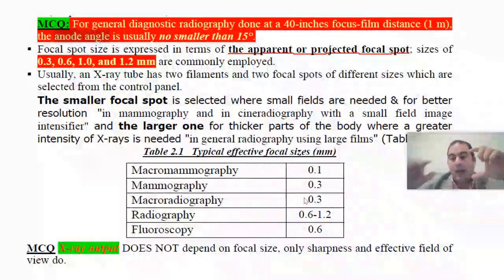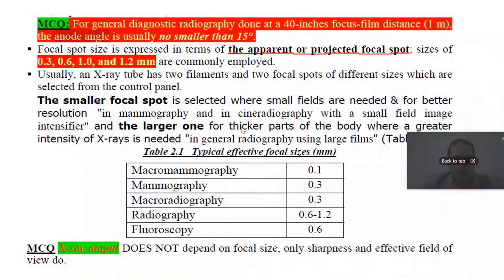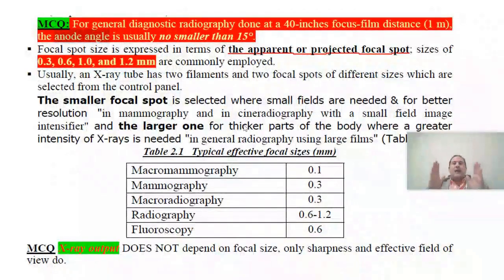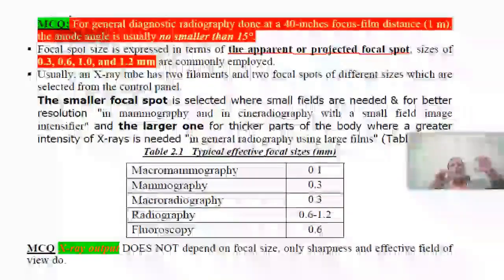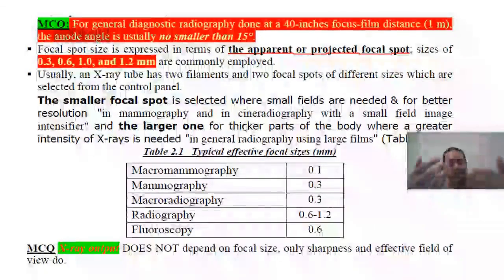The actual focal spot size, or the area that will be bombarded by the electrons, will increase. For example, the distance remains the same. But the whole idea is that the area exposed to the beam of electrons will increase with the increase in filament length.